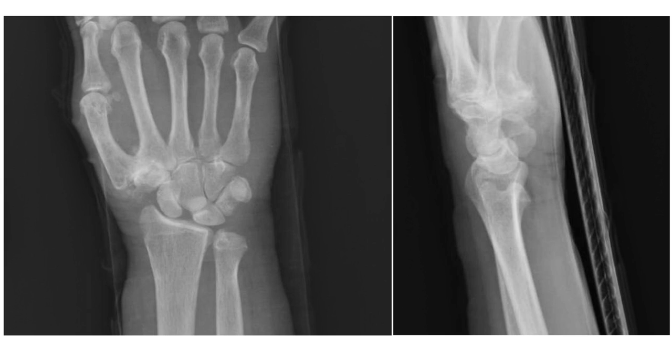This is the x-ray of that patient. The next slide is going to talk to you about the sign shown in this x-ray.